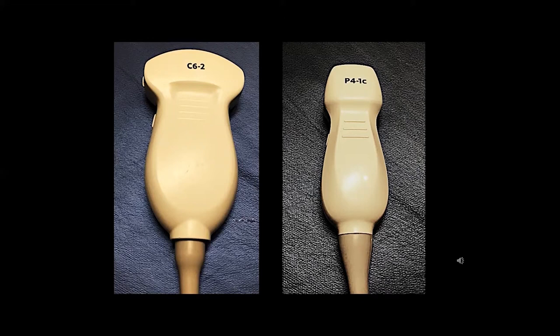So most commonly, you'll use a curvilinear probe shown on the left here. Sometimes you can use a phased array probe, which is especially helpful if you need to use an intercostal approach, as it has a small footprint and can better see through the ribs.